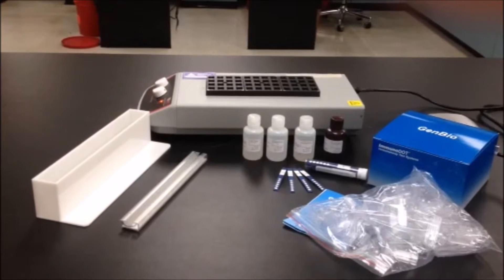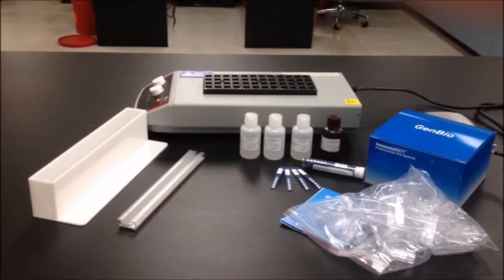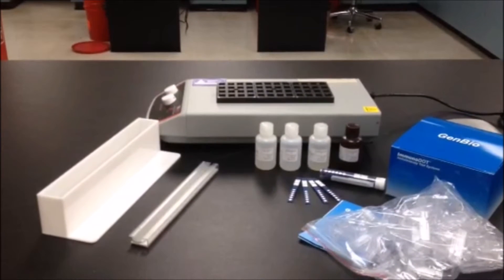This video is for the purpose of demonstrating the method followed for immunodot immunoassays, but you should follow the complete package insert for performance of any immunodot kit.